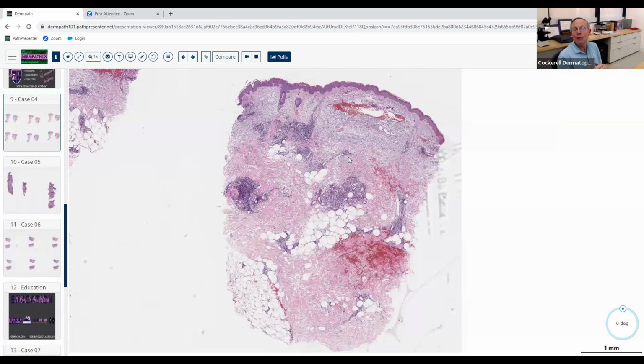That's how you come up with a differential diagnosis, and then you ask, is there anything else that can make it more specific? So general pattern, maybe 10 things, 20 things can cause that. Then you start looking at more specific entity things, like additional information in the dermis or the epidermis. Then you hone the diagnosis, and you finally come up with something specific that correlates with the clinical. So what pattern are we looking at here?